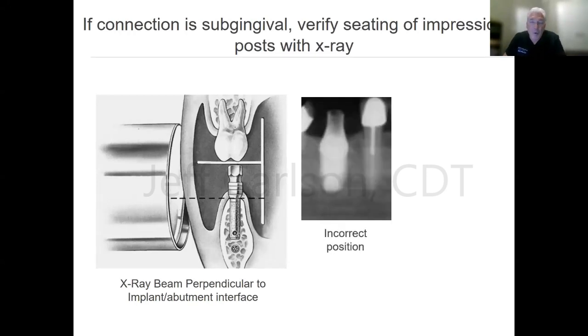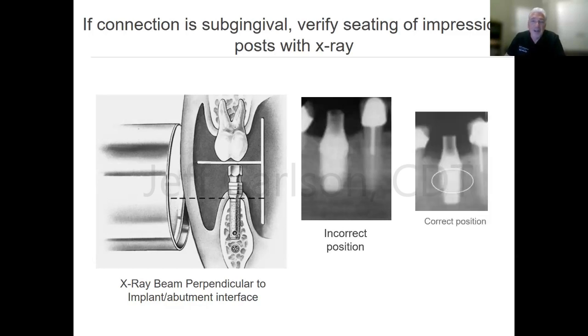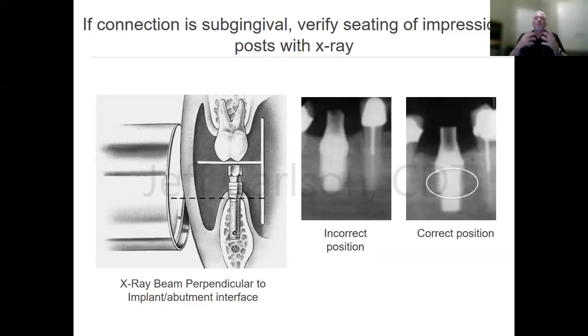This is for our doctors who are placing abutments and want to know, how do you know if your abutment is seated completely? People think, I'm just going to use a panoramic, but panels may not always work based on where the implants are. There's some distortion as you come around the curve of the arch, the corner of the arch, I should say, that it may not pick this up completely.